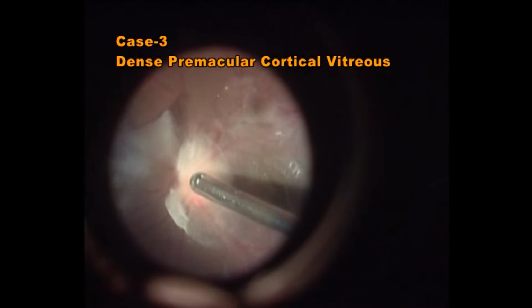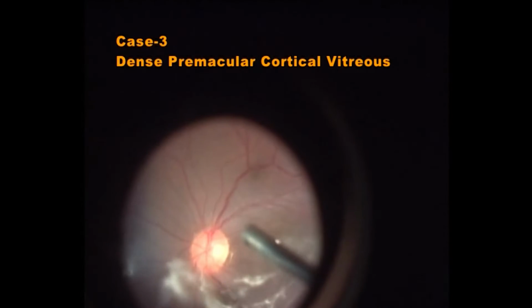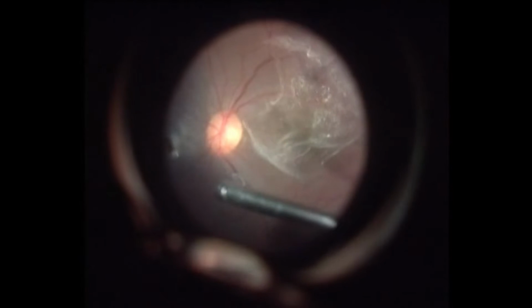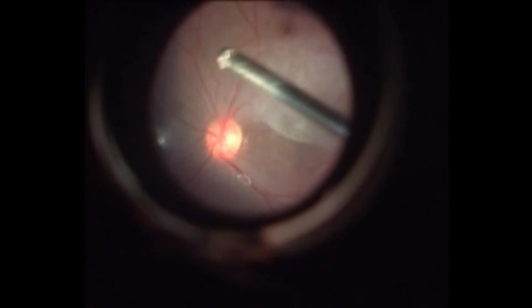This patient is a 32-year-old male who was referred for surgical management of a dense epiretinal membrane. The epiretinal membrane in this patient turned out to be a densely thickened and loosely adherent posterior hyaloid which separates easily during PVD induction and is excised, leaving a smooth and normal macular contour.